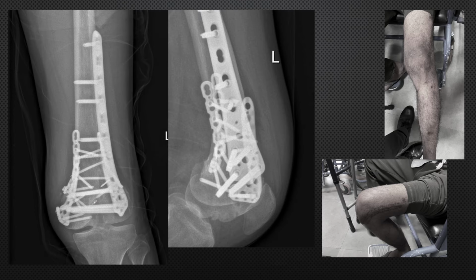And this was the 6-month follow-up radiograph of this patient. You see the remodeling is still happening on the medial side. Everything is united and remodeling is still happening on the articular side. So even the articular side remodels if you have reduced it properly. The important thing is that you have to reduce the fragments well, and they should be stably fixed. And here in the notch part, we are not sure what is happening, but the patient has reasonably good movement. He has almost 130 degrees flexion and full extension.